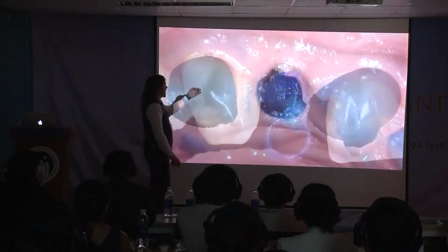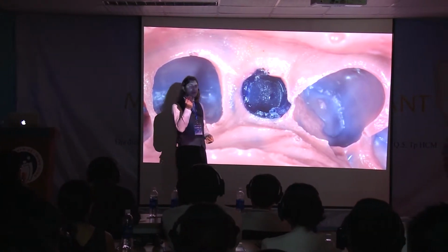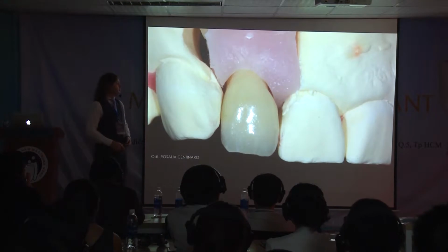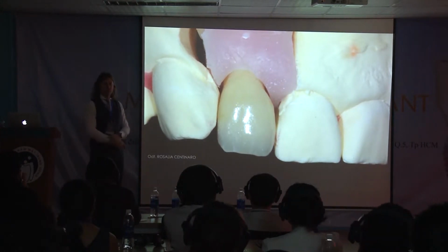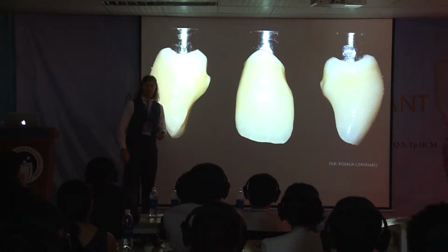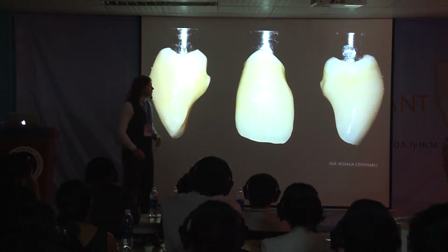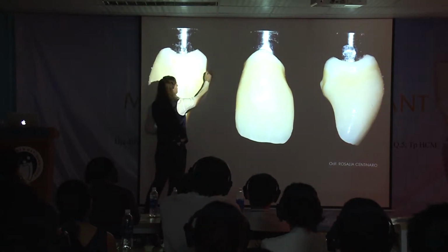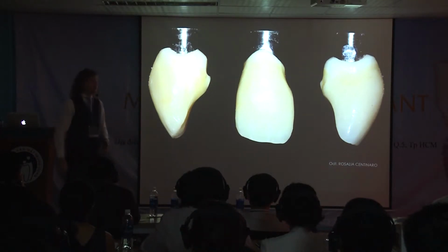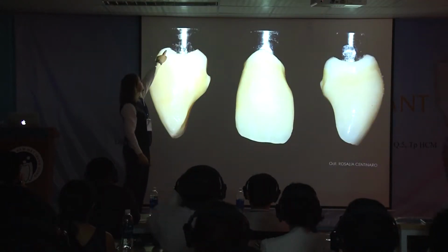I put the cap, I take the impression of the position of the cap. The technician takes the replica and puts it back. He can create the tissues. It's a very cheap way to create prosthodontics, this one. And this is a zirconia ceramic crown. And again you see the notch, the palatal notch to remove it, because perhaps in the future I want to remove it. And you can see the very horizontal emergence profile.